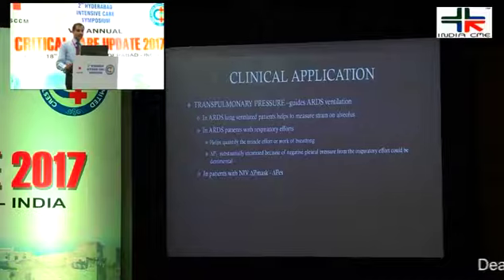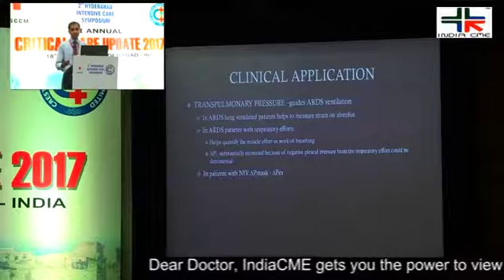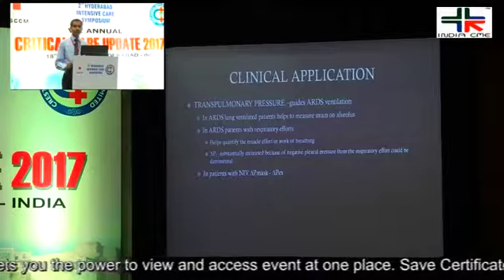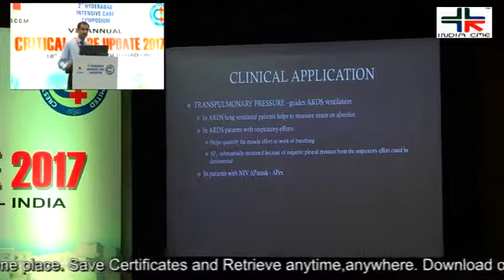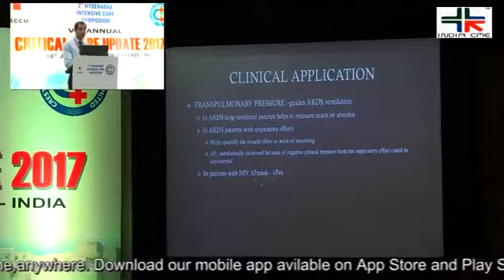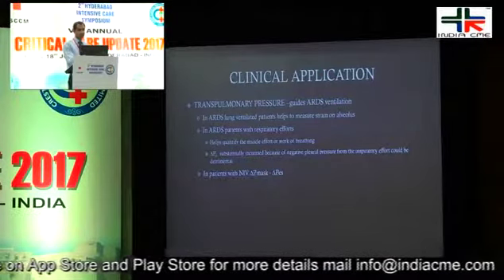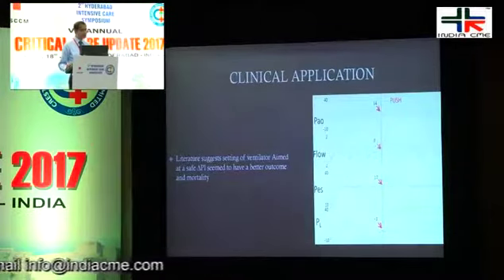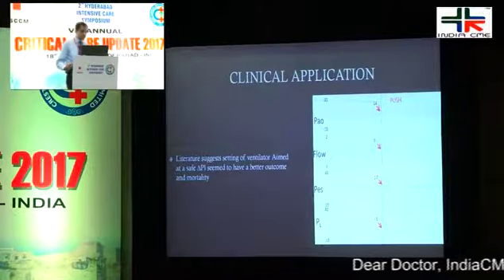In patients on NIV, who are on an NIV mask, it's also important to measure the transpulmonary gradient. Most of our NIV machines, at least the older generation ones, did not even have a measure of tidal volume, and even if you get a tidal volume on that, I don't think it will be the most accurate, because there's a lot of leak, and it will measure a whole lot of gas which is being leaked out as well. So here the concept of transpulmonary pressure is measuring delta P within the mask, or the change in the positive pressure within the mask, minus the esophageal delta pressure, and that delta will give you the transpulmonary pressure. Maybe not very accurate, because again taking into account leaks and other things may not be the most accurate, but it is still something which is worthwhile to note.